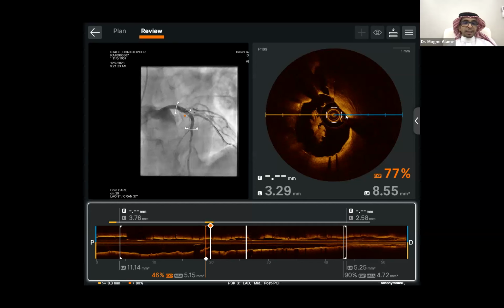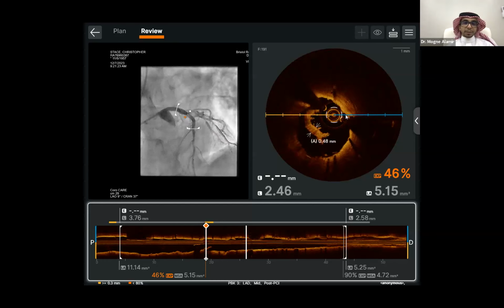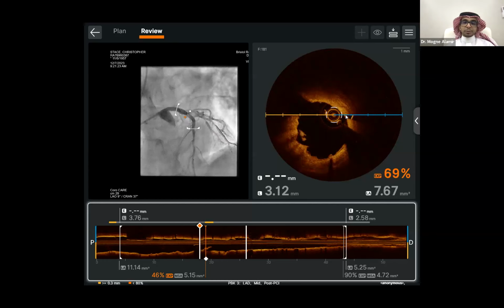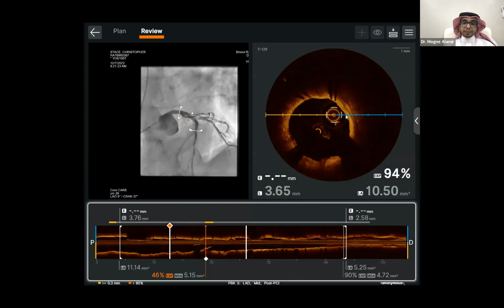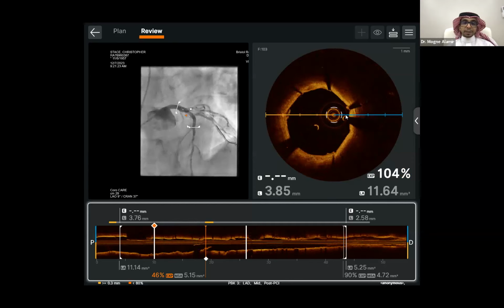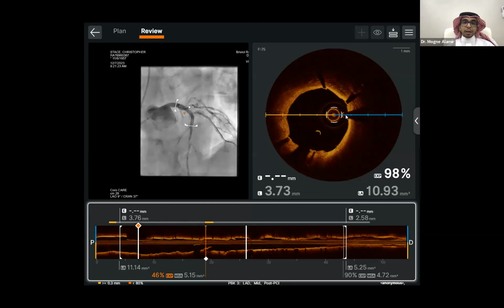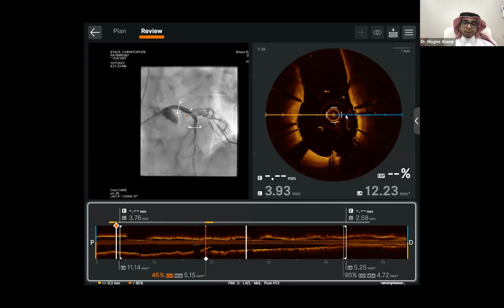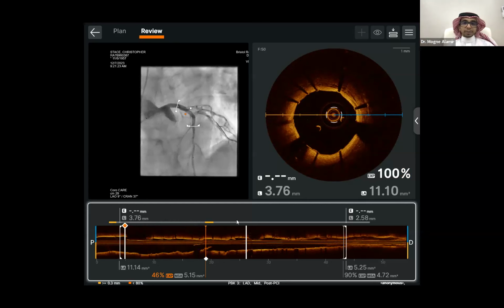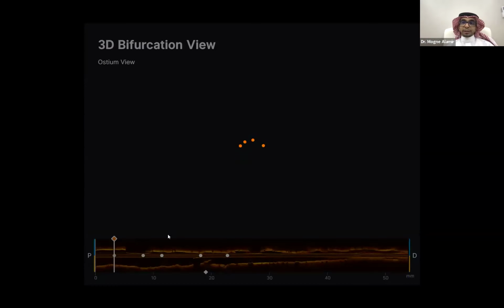Actually, I don't know exactly, because sometimes we have it, especially in ACS patients, but I tend to, if I have TIMI 3 flow, just leave it. If it affects the flow, I'll try to balloon it more. Yeah. Just either to oppose that against the stent or to dislodge that material. If not, and still having a slow flow, I might go and put another stent.